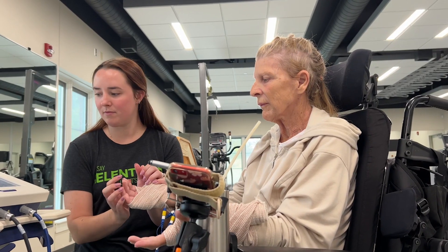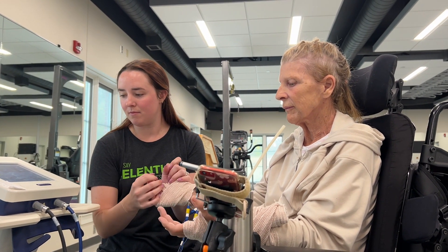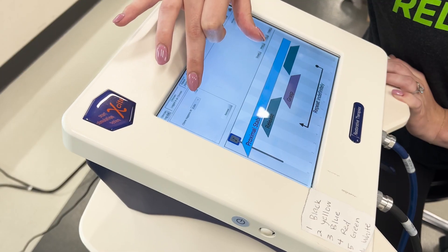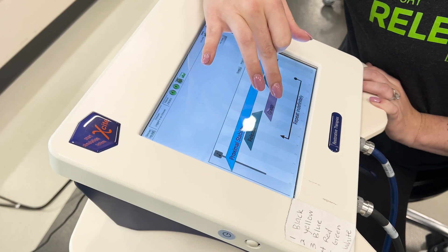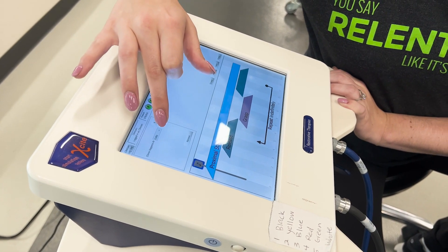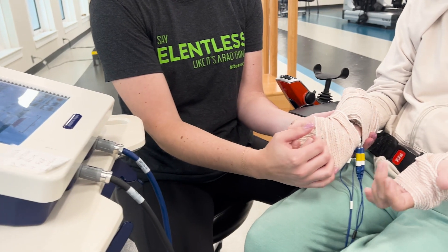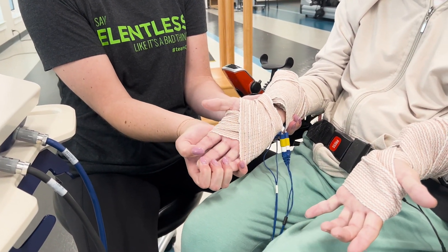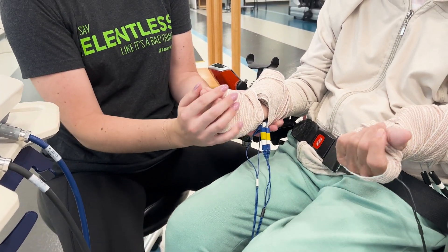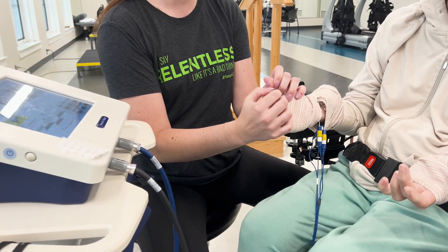Let's go meet Lizzie and Terry on the Excite machine. Hey, I'm Lizzie, an OT here at QLI. And I'm Terry, a resident here at QLI — I'm trying to get normal function on my hand. This is the Excite machine. It's electrical stimulation that helps Terry's muscles fire. The cool thing about this is that you can program it in a way that you're doing functional motor patterns like brushing your teeth, brushing your hair, or bringing a fork to your mouth for breakfast.